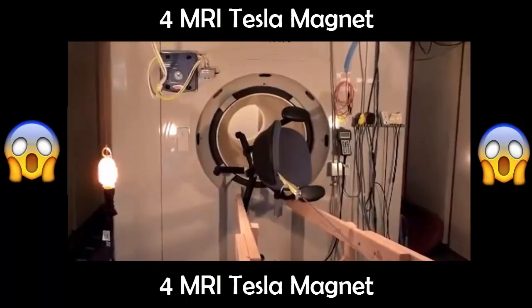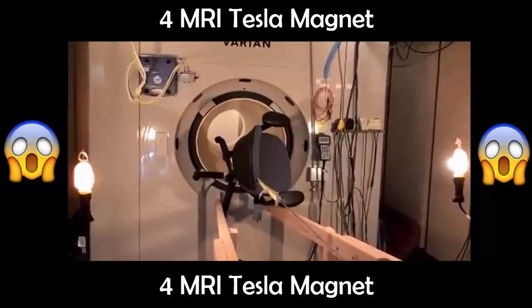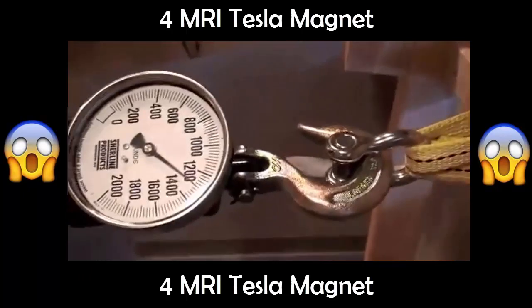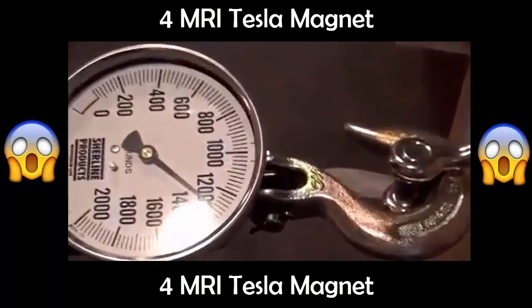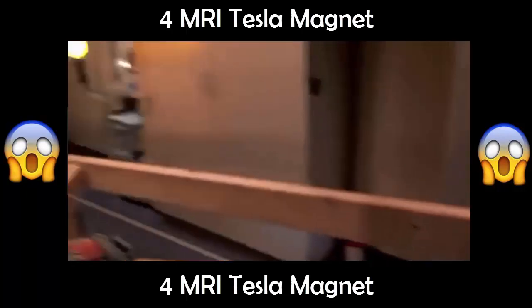We are at 700 pounds. And we have jumped to 1,300. The most magnetic stuff is right here, still on the top of the chair, so we're just about to hit the sweet spot.